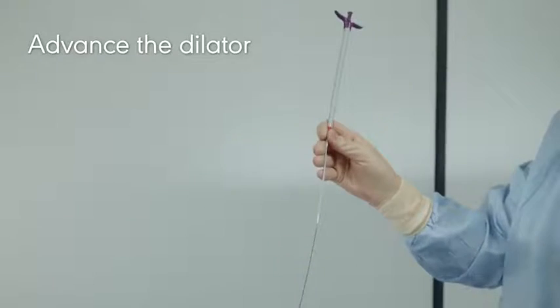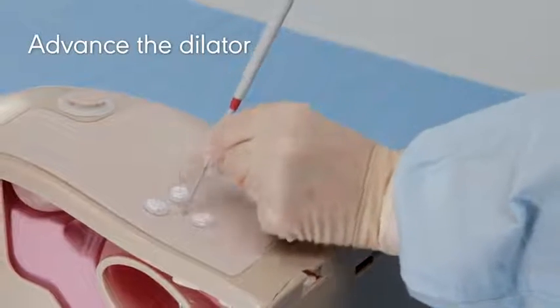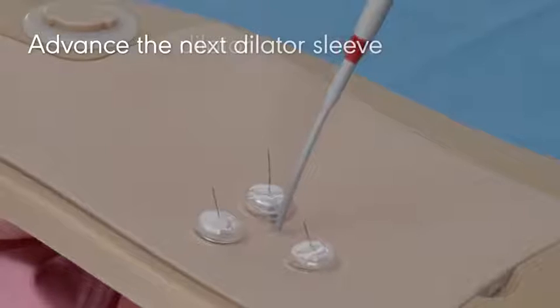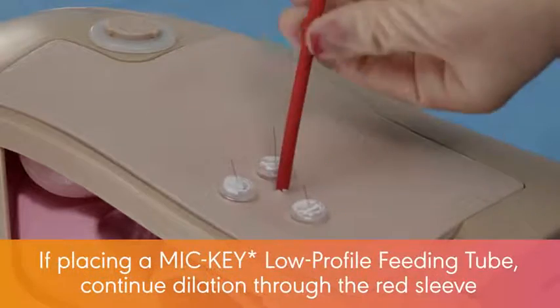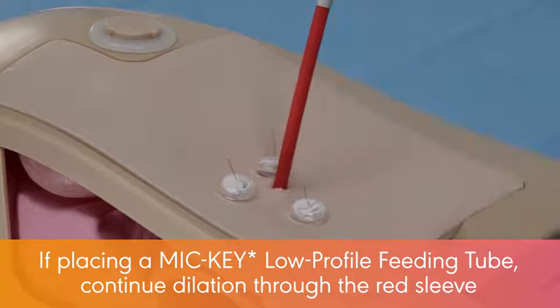Advance the dilator top over the pre-positioned guidewire, through the tissue, and into the stomach using a clockwise and counterclockwise twisting motion. Advance the next dilator sleeve into the stomach until a physical stop is felt. If placing a MICI low-profile feeding tube, continue dilation through the red sleeve.